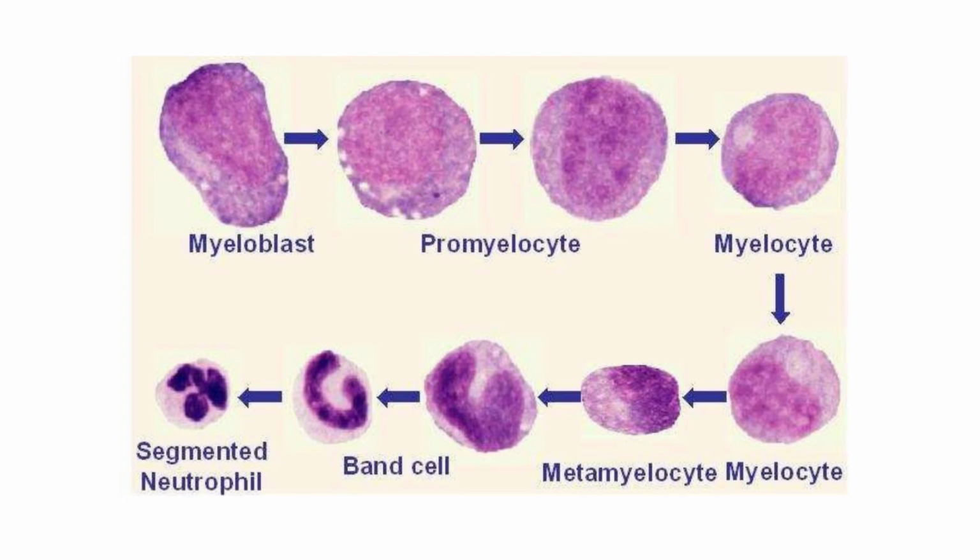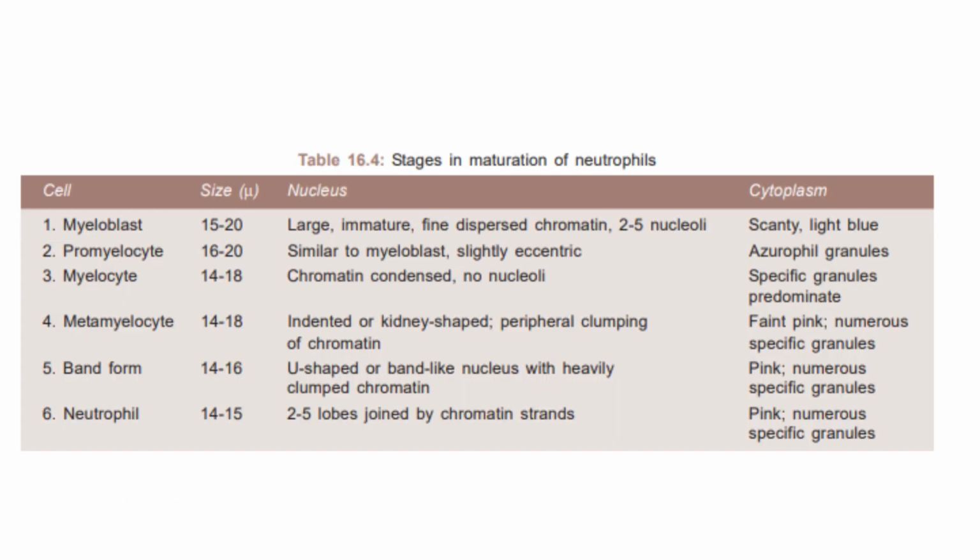The very first thing that you see is a decrease in size of the cell, a decrease in size of the nucleus, and the granules are becoming less and less coarse. I know the picture is not that clear. Blast and promyelocyte usually have nucleoli. Myelocyte may or may not have nucleoli, but blast and promyelocyte usually have nucleoli within them. And metamyelocyte has a very characteristic shape of the nucleus as well. Okay, so this table is summarizing them.